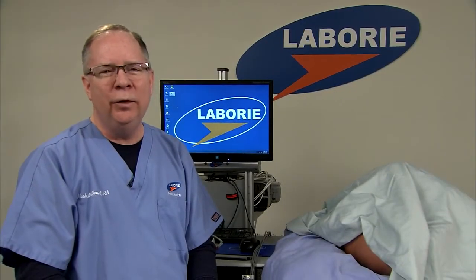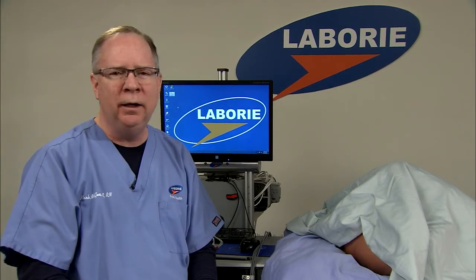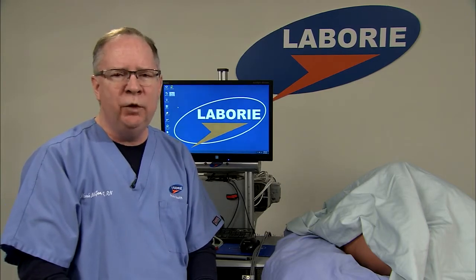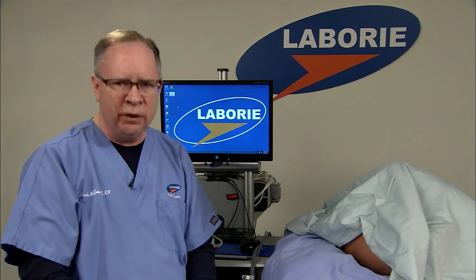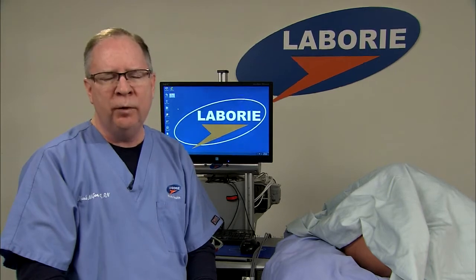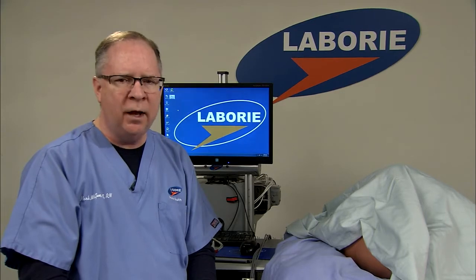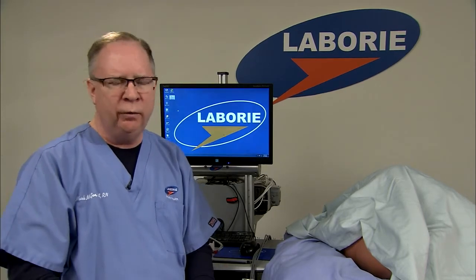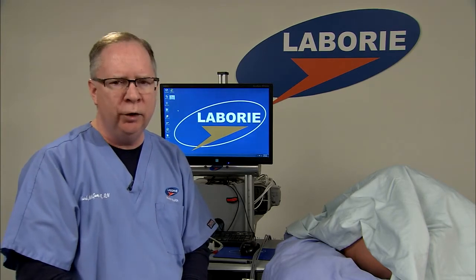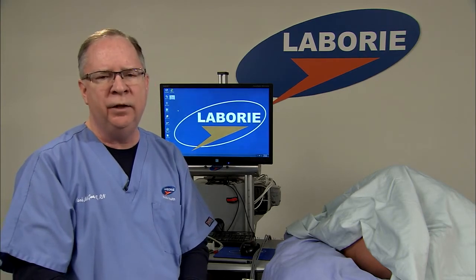We're going to be going over the three different components of the test today. One will be the electromyography, or the EMG, of the anal sphincter. We'll be doing different maneuvers to test how well the sphincter is functioning and if the patient is able to control it. We'll be going over anorectal manometry, which will be measuring the function of the anal canal and its relationship with the different sensations. Plus, we'll be reviewing and testing the pudendal nerve to see if it is functioning correctly and how it innervates and affects the activity of the sphincter.